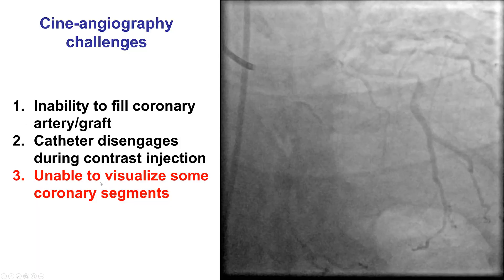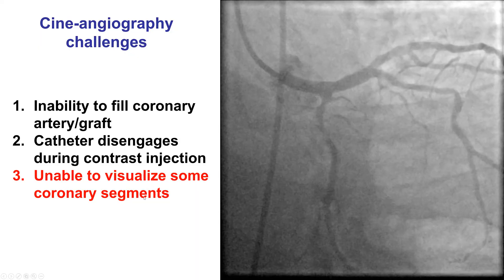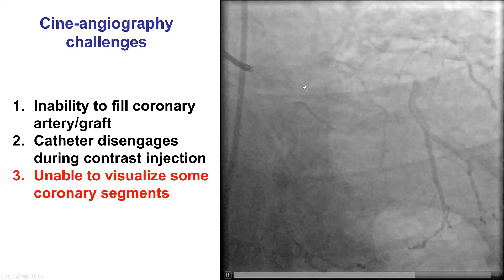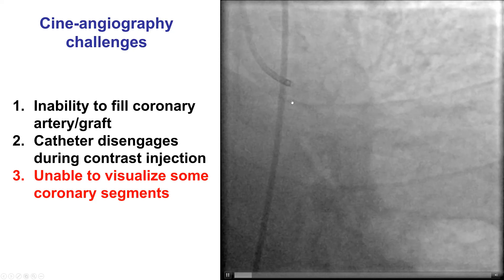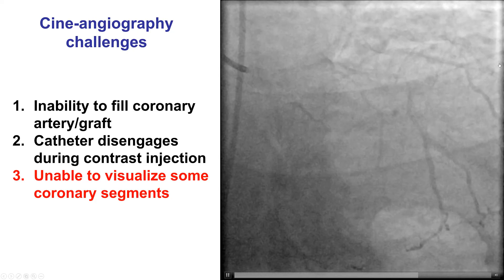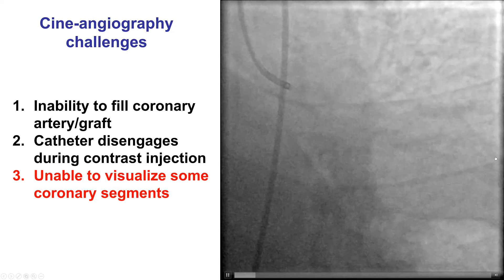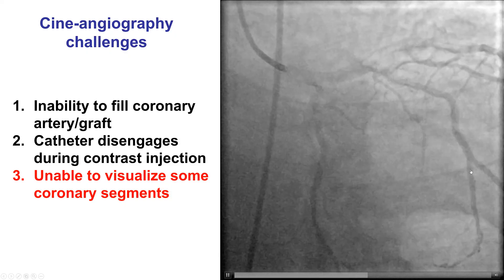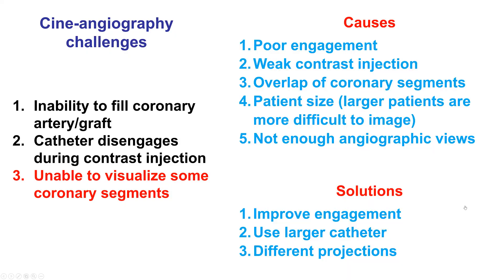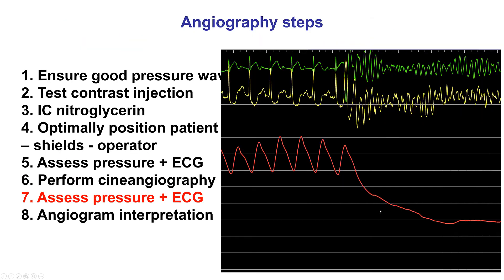A third challenge with cine angiography is inability to visualize some coronary segments, and this sometimes has to do with setup. In this case, the patient was not positioned optimally and the image receptor could not go all the way to visualize the distal portions of the LAD and the obtuse marginals. The most common causes are poor engagement, weak injection, overlap of coronary segments, large patient, or insufficient views obtained. Solutions include better engagement, use of a larger catheter, and use of different projections.